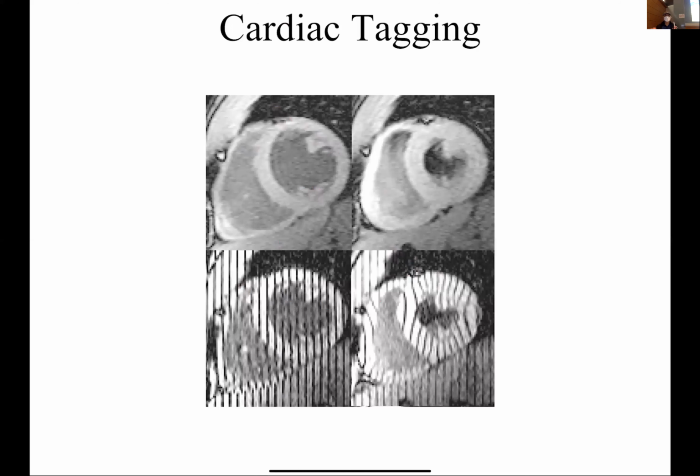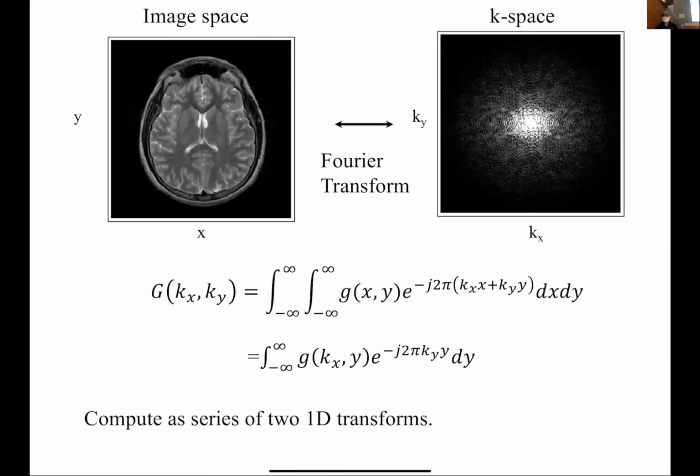We're going to switch gears a little bit, and we're going to revisit imaging. So far, we've talked a little bit about how I have an object in what I call image space. What I'd ideally like to do, MRI gathers data in K-space or the Fourier domain. When I have this data, I can go back and do an inverse 2D Fourier transform and go back to here. So let's look at this process of the 2D Fourier transform.